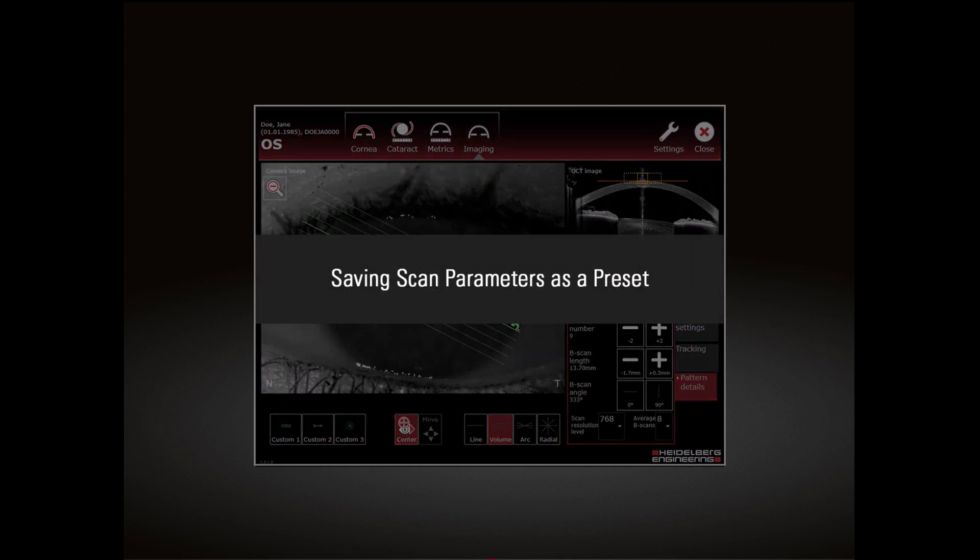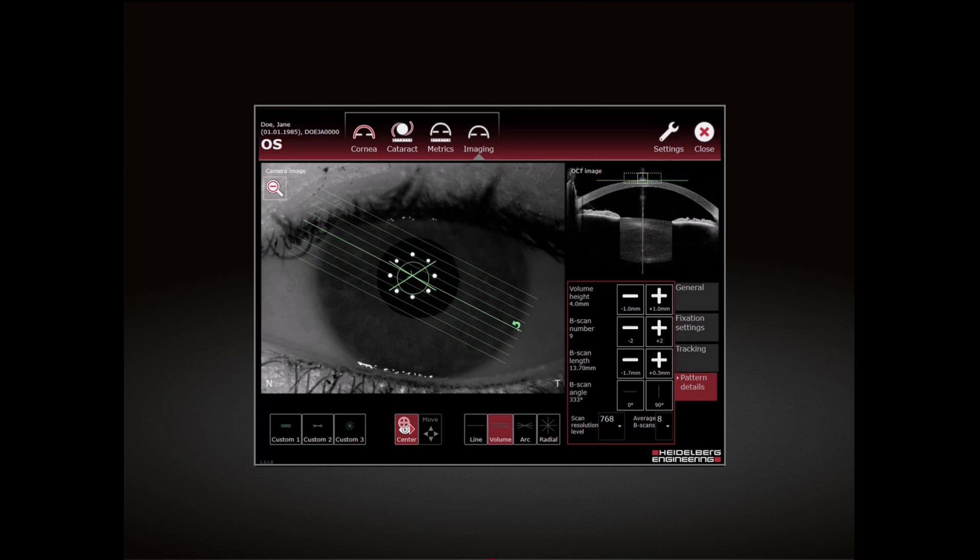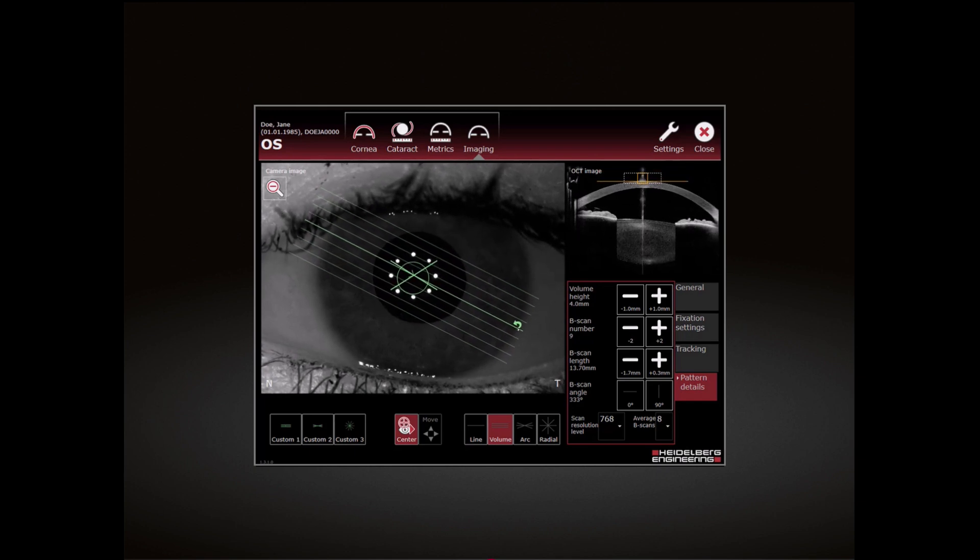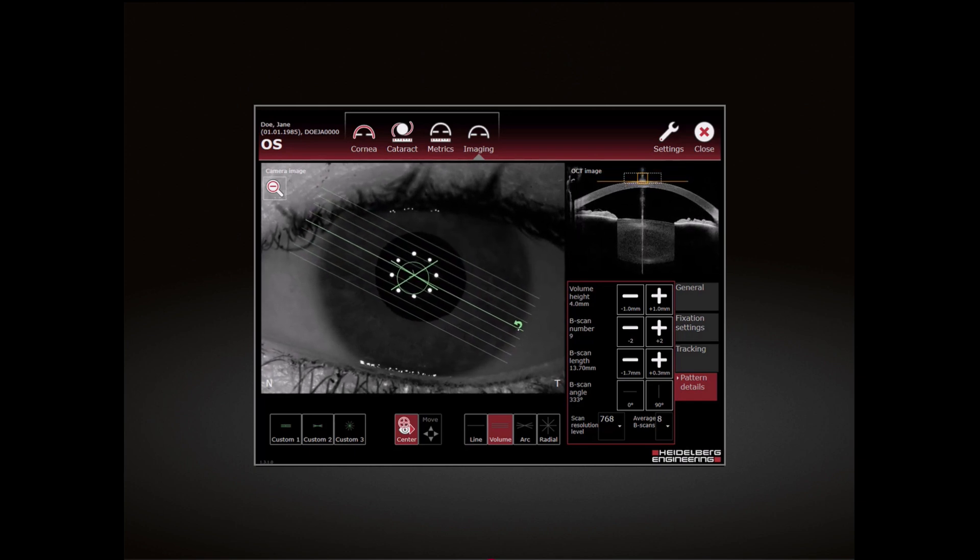Saving Scan Parameters as a preset: To save the defined scan settings, tap and hold Custom 1, Custom 2 or Custom 3.